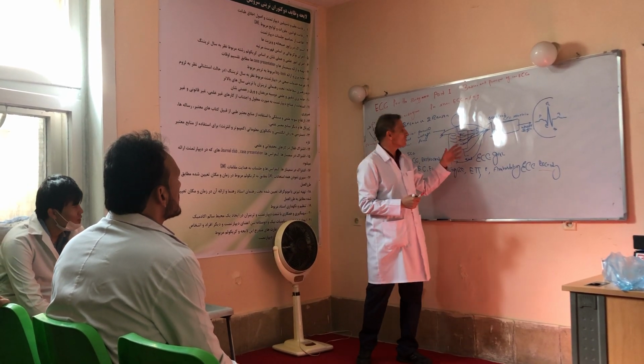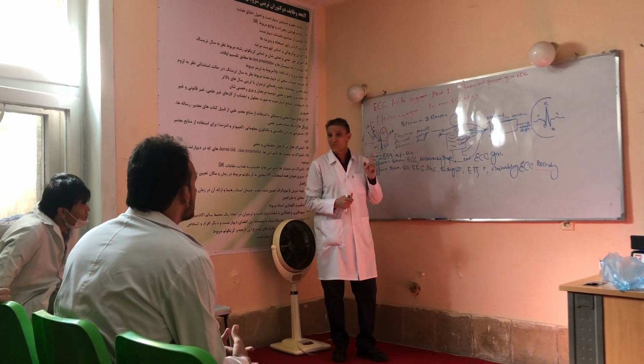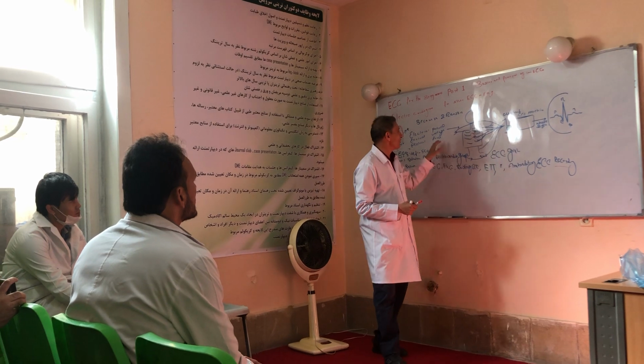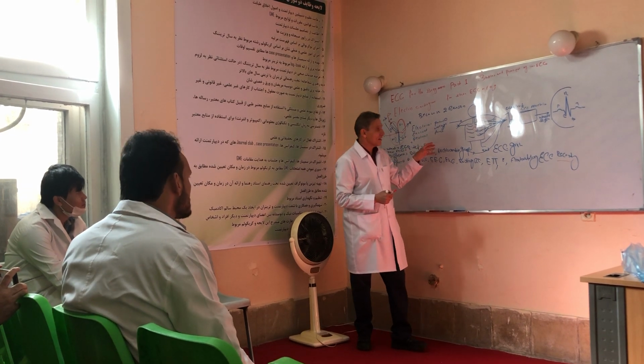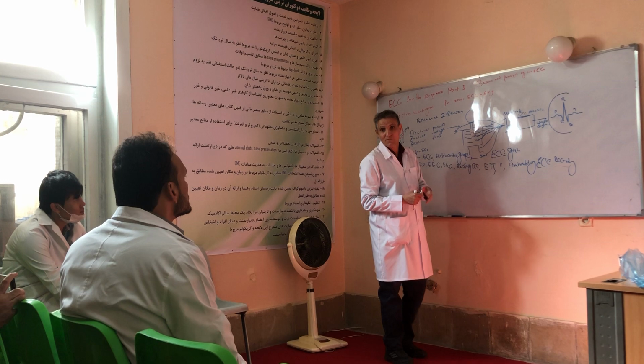Then this electrical force should be presented by a vector. In physics, every force is presented by a vector. When we are talking about the vector, we should think about the electrical force. They look different, but they give the same meaning. Then this electrical force from this heart goes to the outer surface of the body.